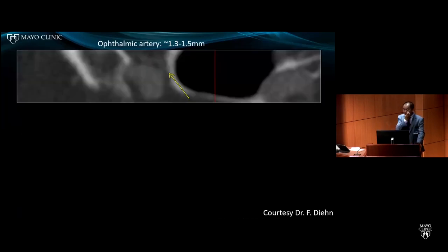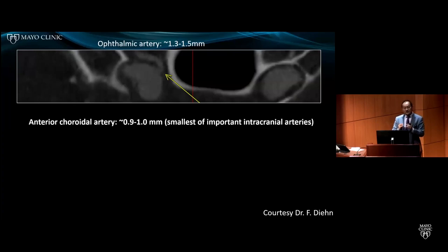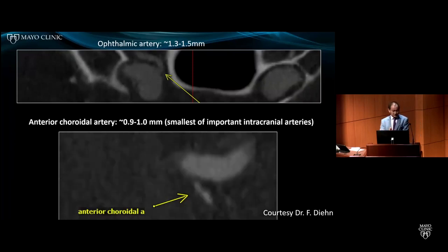But when we keep moving, now we look at arteries that are just a little over 1 millimeter. It becomes questionable whether we can see it or not. I have a little bit of a hard time. Maybe the radiologist can see them. But look at photon counting high resolution, much better images. Then we go to the very small, sub-millimeter arteries. This is probably the smallest important intracranial artery we need. This arrow is supposed to be pointing to something, but I cannot see anything there. Turn on the photon counting high resolution, and I think I can see it. I think everybody in the room can see this.